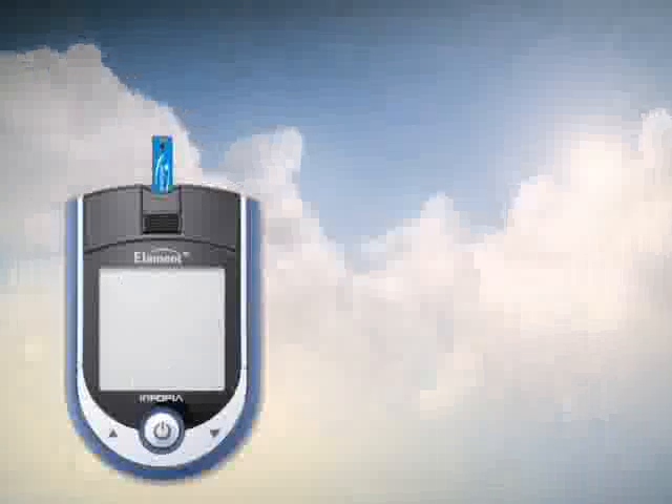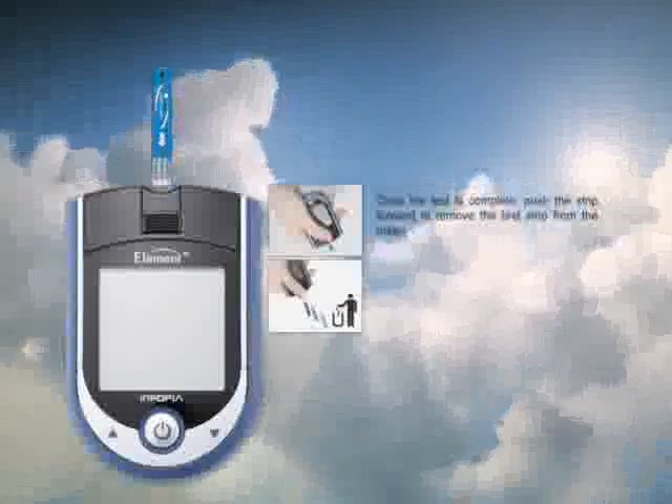Once the test is complete, slide the ejector button forward to remove the test strip from the meter.